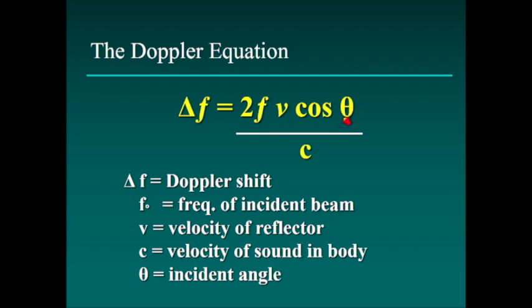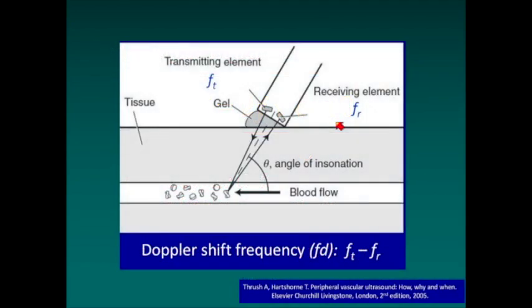And to remind you that the cosine of 0 is 1, and the cosine of 90 is 0. So if you want that maximal Doppler experience, you want to be at 0 degrees incidence. You want to be on the train tracks while the train is coming at you. You will have the maximal Doppler experience before it hits you. And it's all over this speed of sound, which is a constant. So of all those things that you might remember, this one is worth remembering.